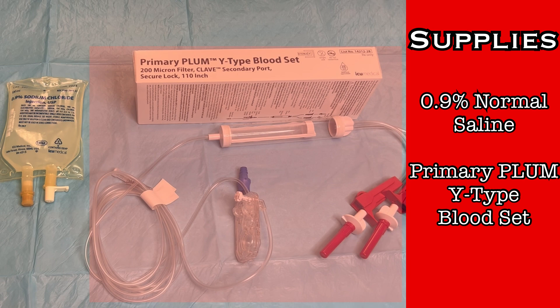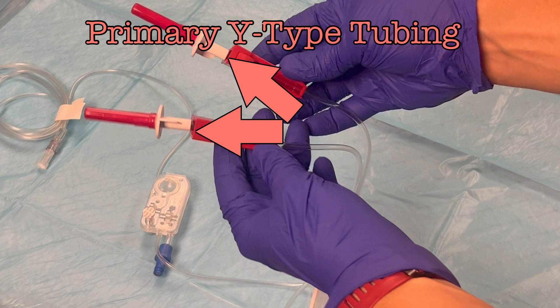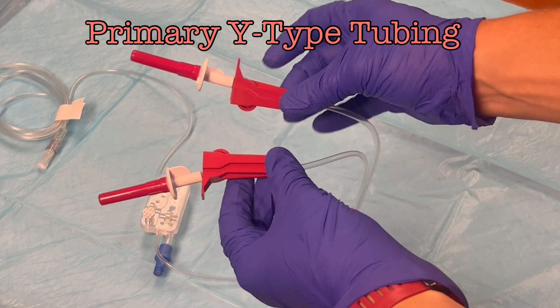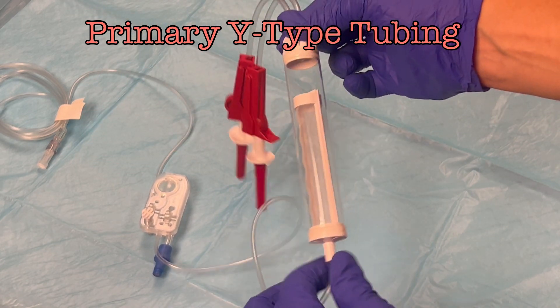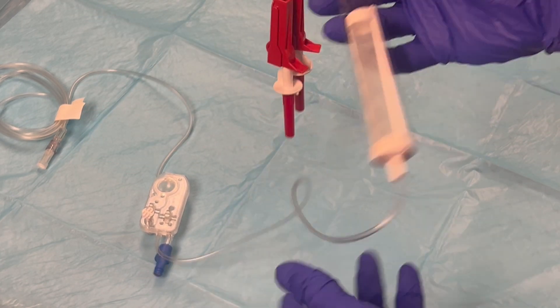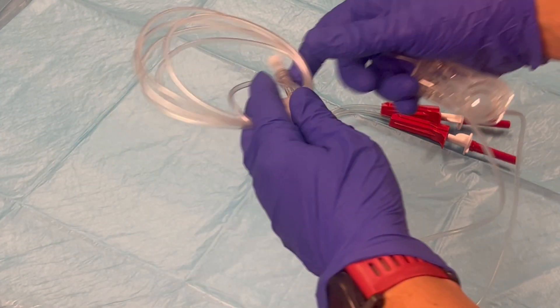Let's take a closer look at the tubing. Y-type blood tubing sets have two spikes — one will connect to a saline bag, the other will connect to a blood product. The two spikes are identical, so it doesn't matter which one is used for either solution. They connect to a large filter chamber, which then connects to a standard cassette used for all Plum 360 tubing, and then it continues until it connects to the patient.